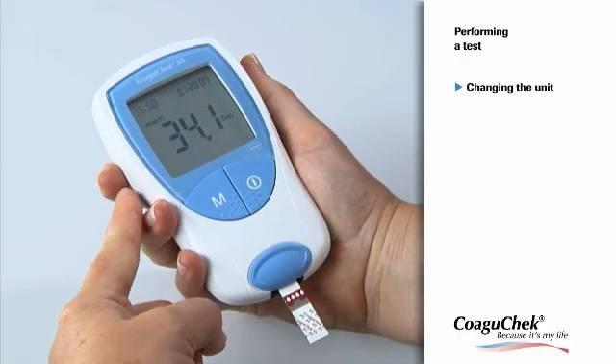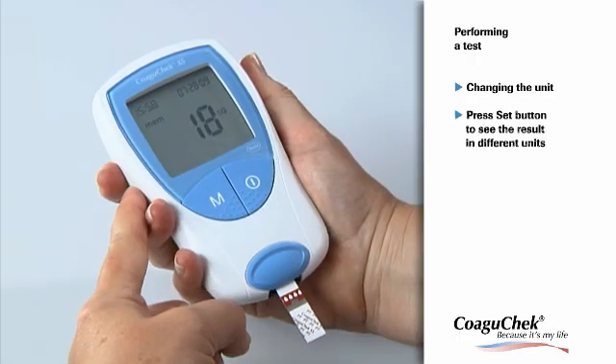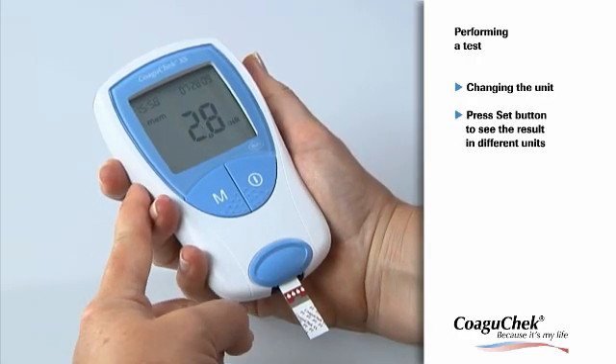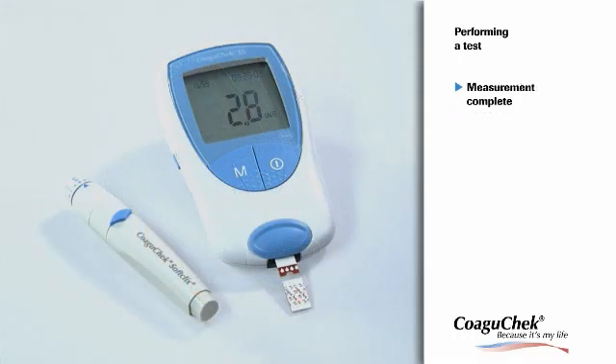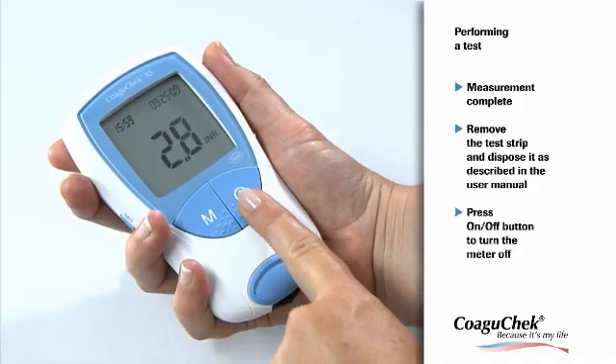Now you can change the unit if you wish by pressing the Set button. The result of the actual measurement is displayed in the INR value, in seconds, or in the Quick value. Congratulations, you have successfully completed the measurement. Please remove the test strip and press the on/off button to turn the meter off.